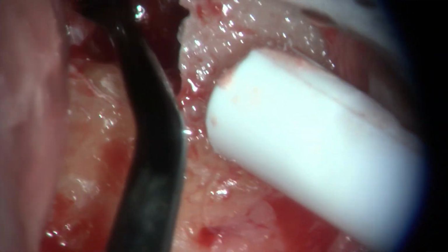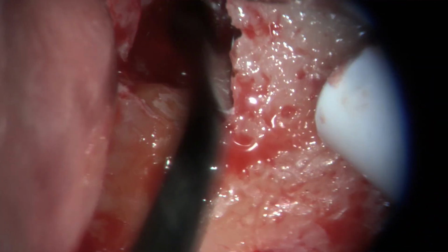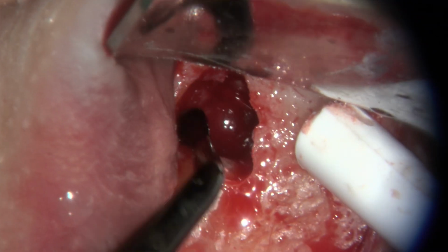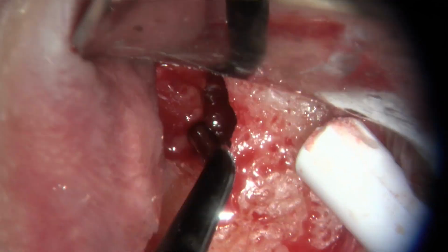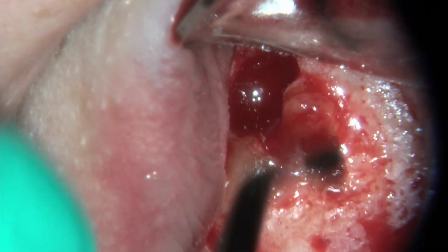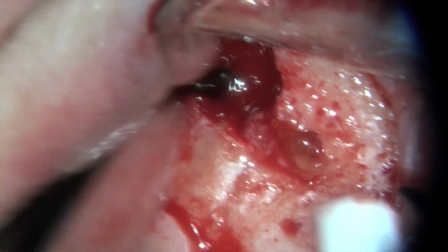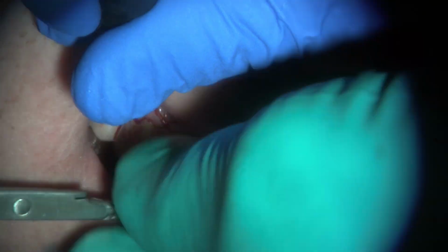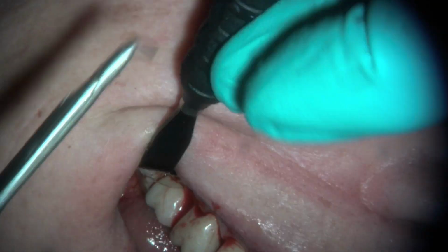And in this particular case, we sent it out for biopsy, and it turned out to be an acute abscess and granuloma. So essentially what we used to previously call a phoenix abscess, which is an acute exacerbation of a chronic abscess. And then we proceed to put in some resorbable sutures. I always like to use gut suture for these types of cases because I want the sutures to dissolve within a week for better and very quick healing. And so this is it. The case is finally done.